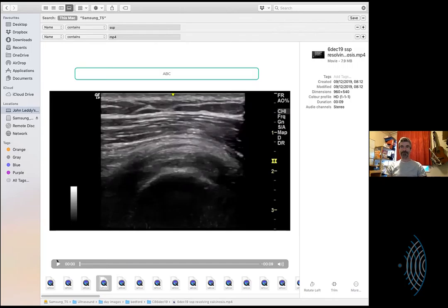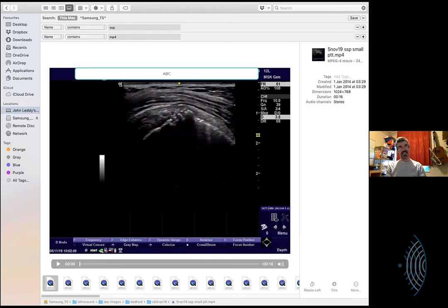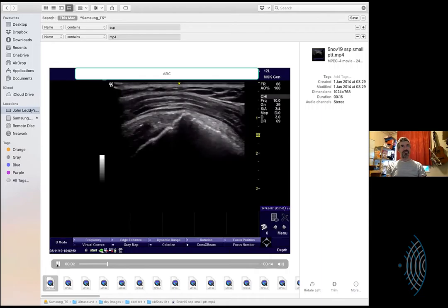I heard Mark say on the video that there are certain percentages to all these unique image presentations, one of which was periosteal defects. And it had a pretty high correlation to at least the sensitivity of a tear. Are you looking for that, or is it just incidental? No. The target area of supraspinatus is quite complicated, and sometimes the appearances are quite tricky to interpret. That breakup of the quality of the cortex and the periosteum, but I think of it more as the cortex, is I think very useful.